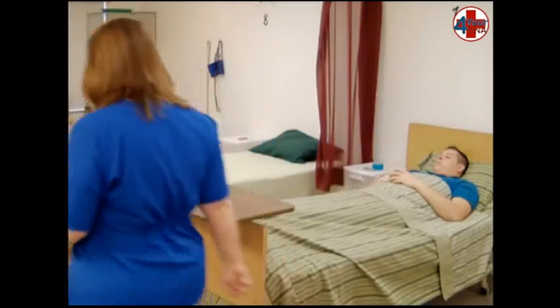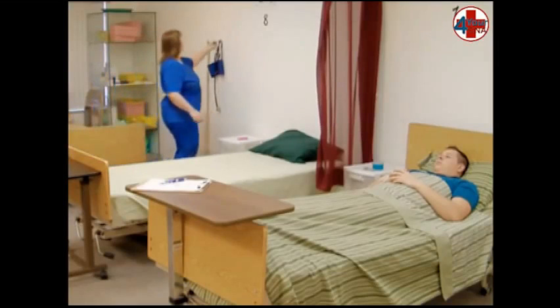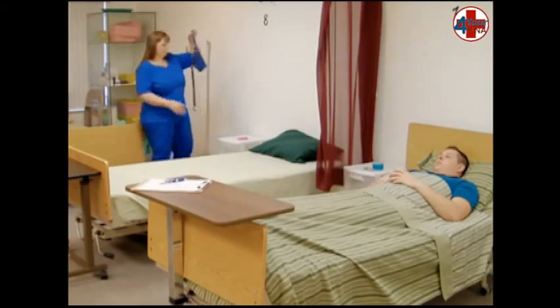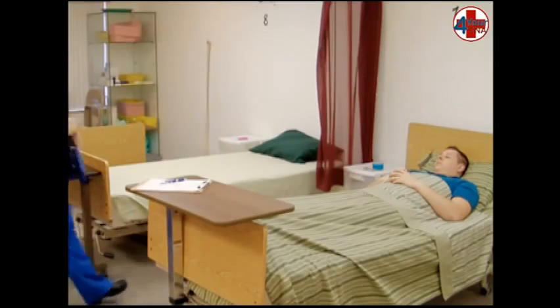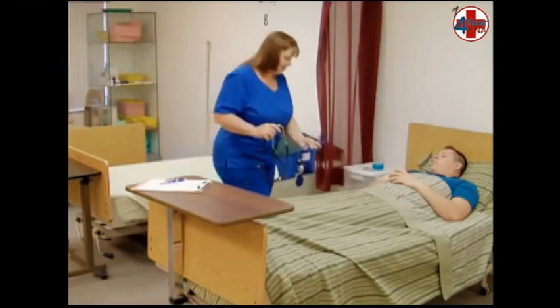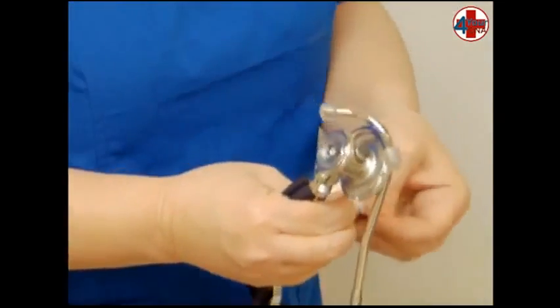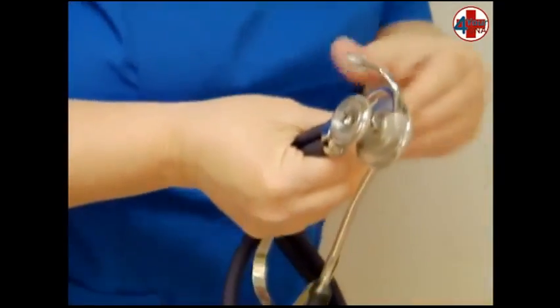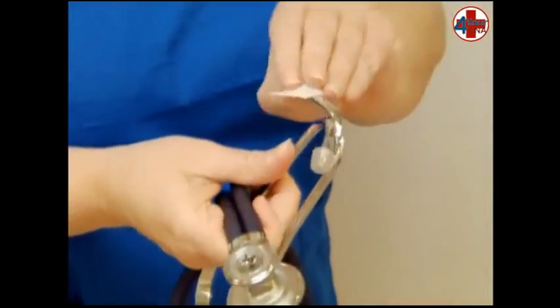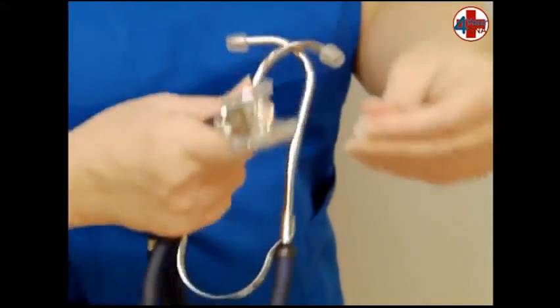When you return, gather your stethoscope and blood pressure cuff from its storage area. Ensure that the blood pressure cuff has been completely deflated. You will be using the testing center's equipment, which includes a double-sided stethoscope so the evaluator can listen as you perform blood pressure. Pick up an alcohol pad and explain to the patient what you will be doing. Open the alcohol pad and clean each earpiece, yours and the evaluator's, and the large diaphragm on your stethoscope. Throw the alcohol pad away.